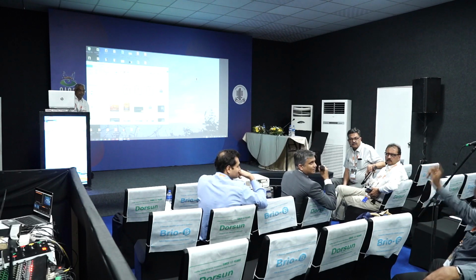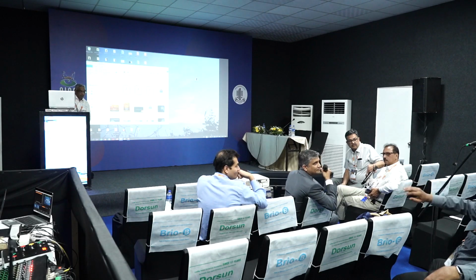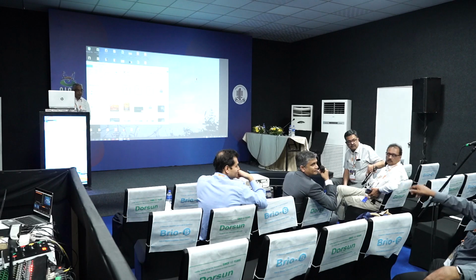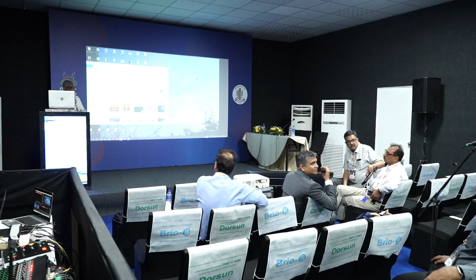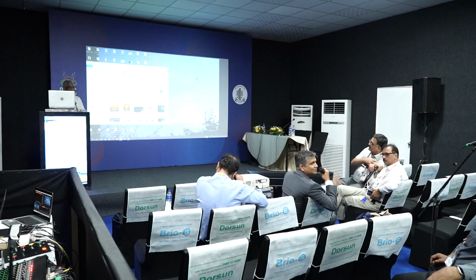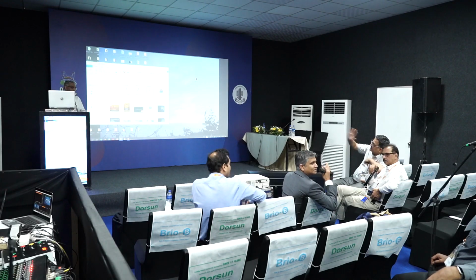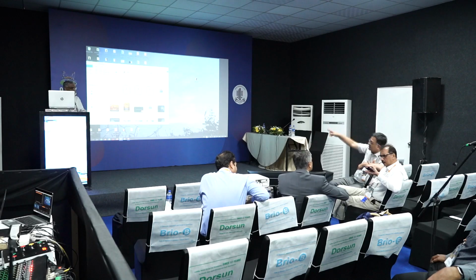What we have seen is the target which you do is just like a photocoagulation, just to contract there. That's it. So we don't see much inflammation post-operatively. I have done at least 5-6 cases like that where pressures are not getting controlled on maximum medication, you do something. The good thing with the endoscope is you can actually see the burn.